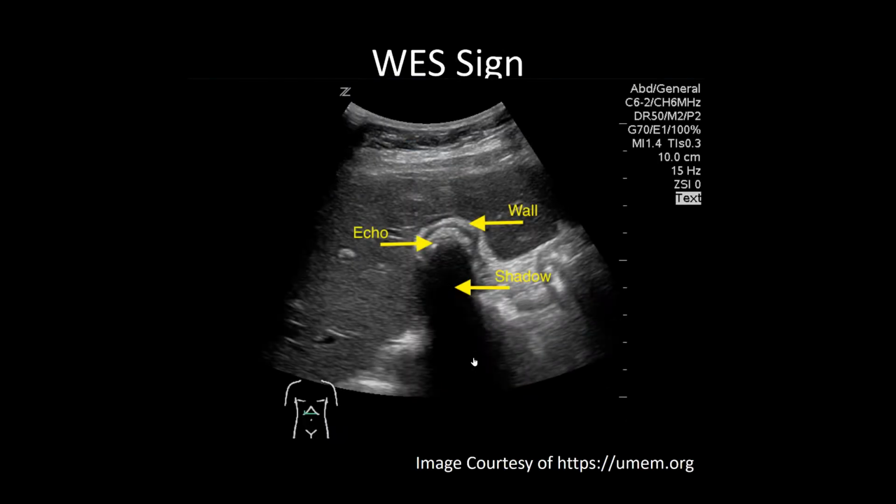Occasionally, the provider will encounter a patient who has recently eaten. In this case, the gallbladder may be contracted, in which case we will not find a large anechoic structure in the right upper quadrant. The WES sign is a common finding of gallbladder pathology.